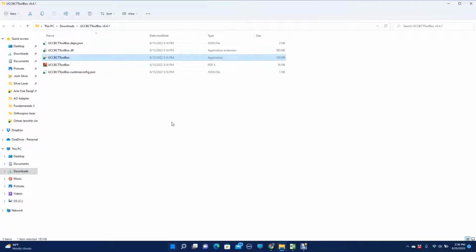Okay, hello everybody. This is Dr. Josh Silver, and I have created a thing called the Toolkit that I wanted to show with you for how we can use this to help do better upper cervical analysis. And I created this out of a need that I found in my own practice.